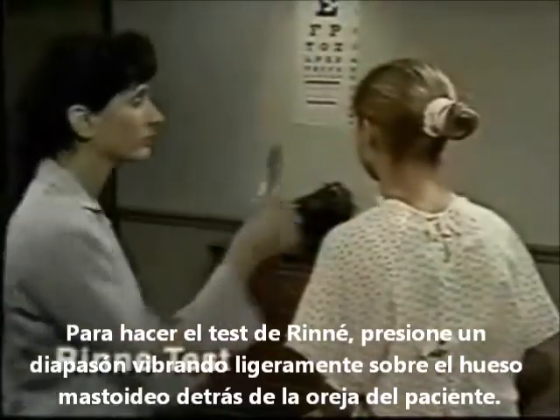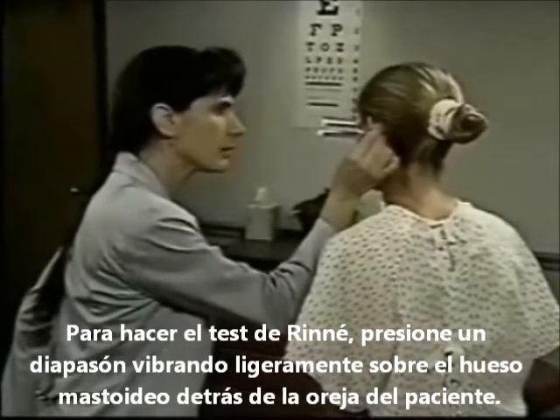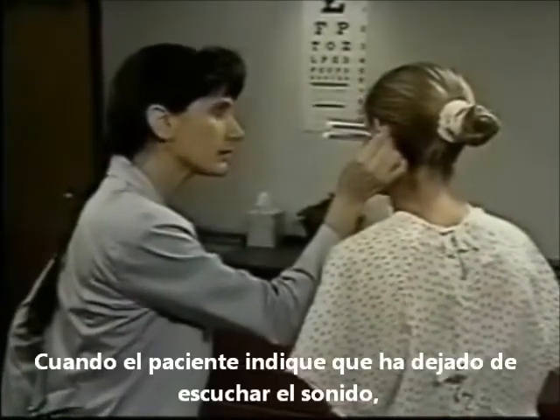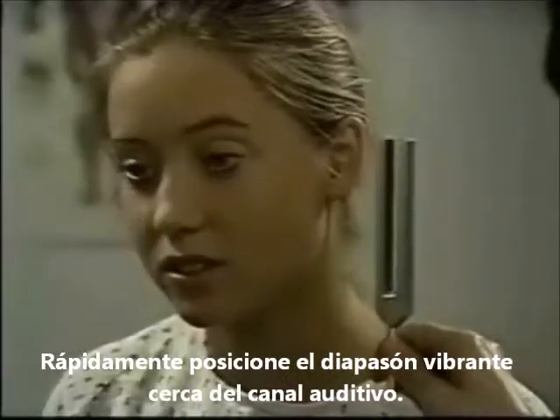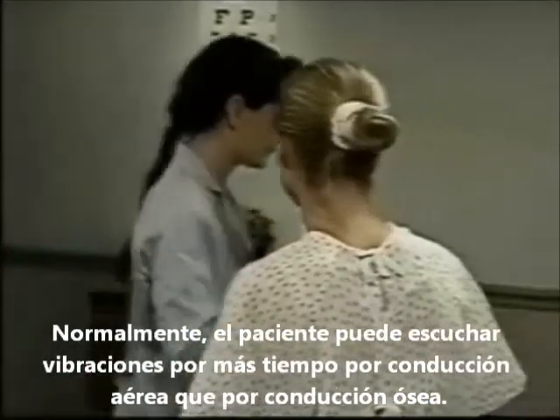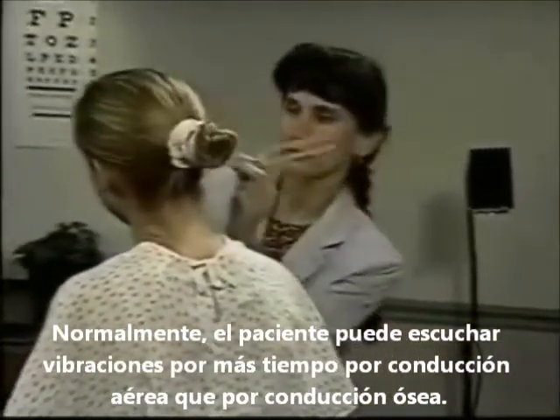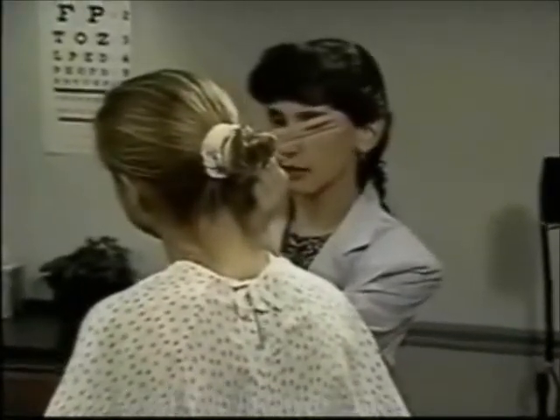To do the Rinne test, place a lightly vibrating tuning fork on the mastoid bone behind the ear. When the patient indicates that the sound is no longer heard, quickly place the vibrating fork close to the ear canal. Normally, the patient can hear vibration longer through air than through bone. Can you hear this? Tell me when it stops. Repeat the test on the other ear.